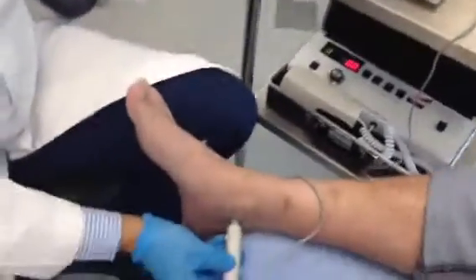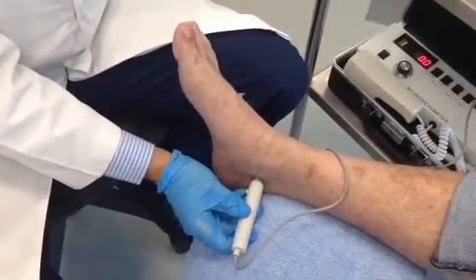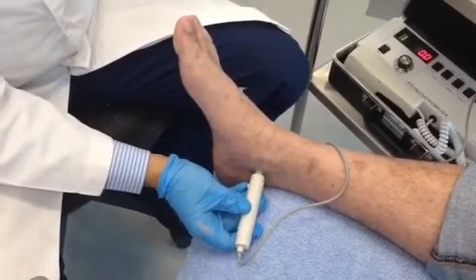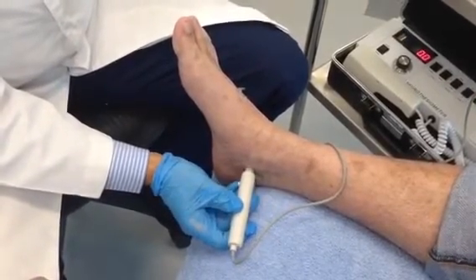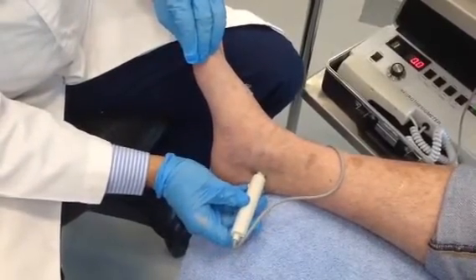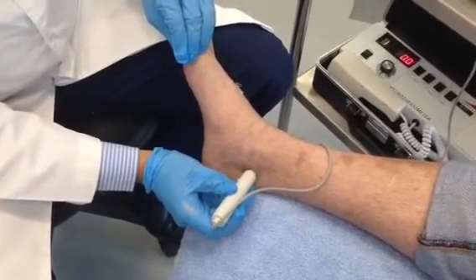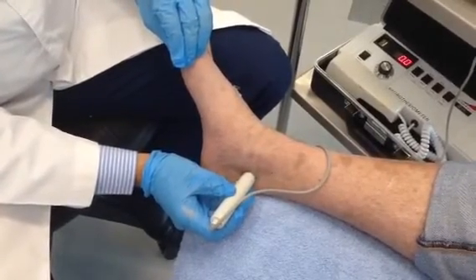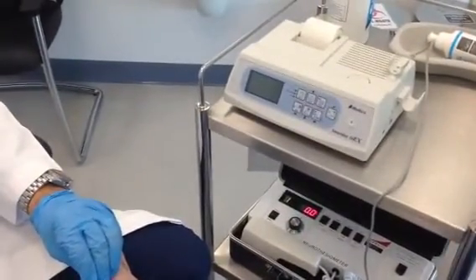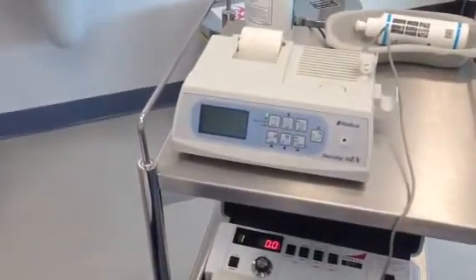We can also check the posterior tibial pulse. Again, very good elasticity — biphasic sound, meaning a double sound — and on the screen a triphasic triple wave.